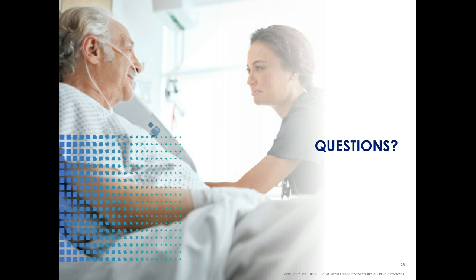So if we're talking specifically about RRP technology, it's obtained from the SpO2. Just like when you're gathering your SpO2 reading, you ideally want someone who has good, warmer hands, higher hemoglobin, less motion, but it's really based upon the technology of the SpO2 supplier. Masimo is a good supplier for SpO2, good technology, and it would be based off of their accuracy.